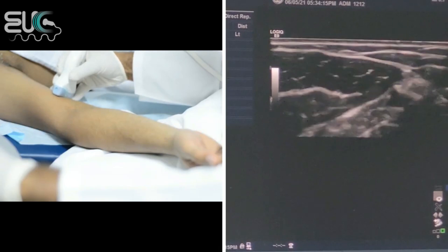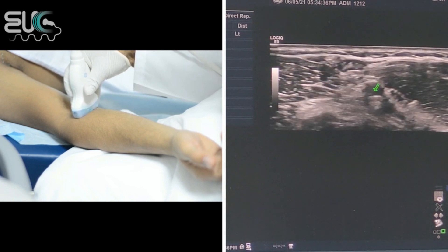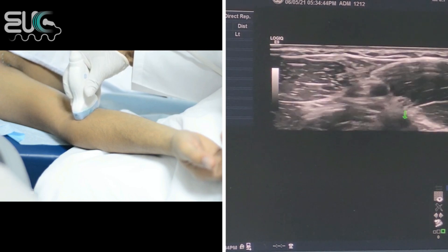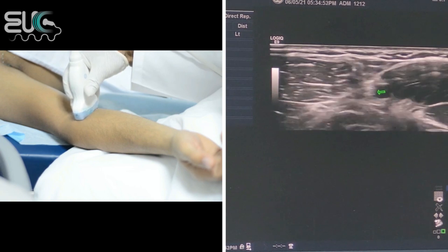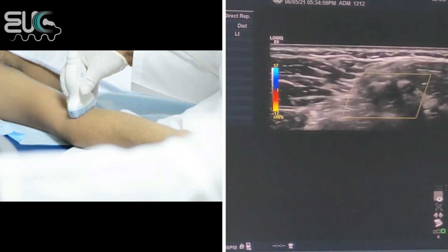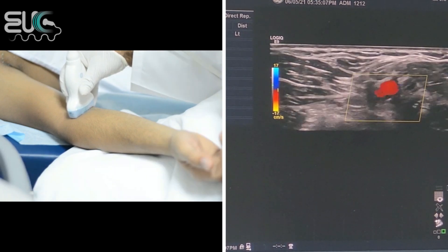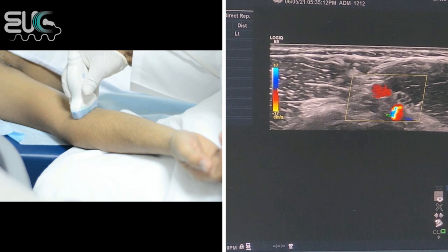I will follow the brachial artery at the cubital fossa. Here the artery divides into two. One will move superficial and the other will pass deep. The one which passes deep will become the ulnar artery, and the one which moves superficial will be the radial artery. We can see that again with the color. Here we have the brachial artery at the cubital fossa dividing into the radial artery and the ulnar artery.